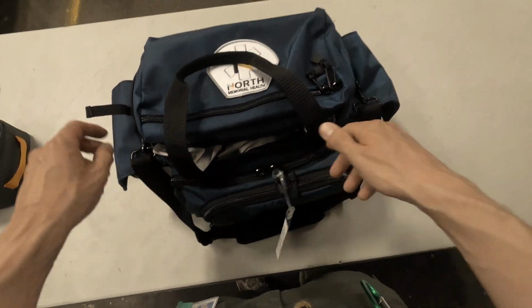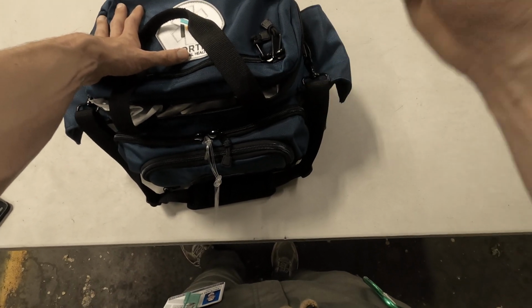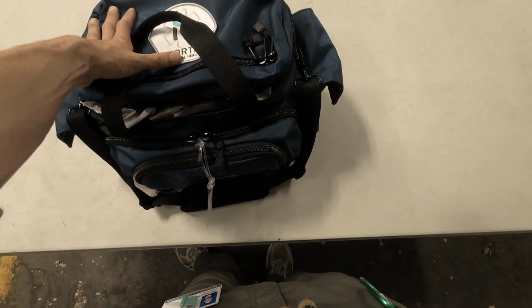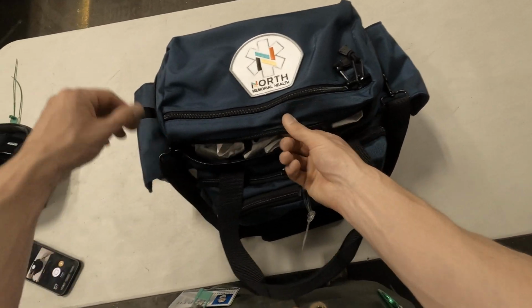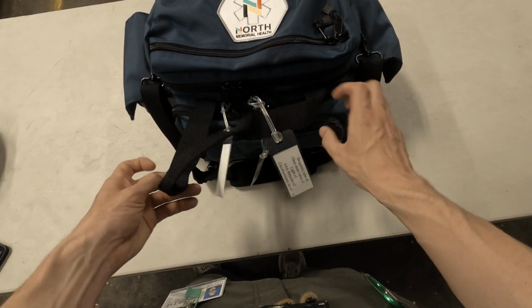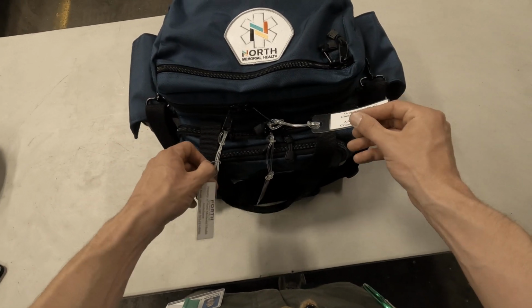So if for some reason a pediatric tube has a broken cuff, or if you need to put in a cuffed tube, you can put the bougie down the tube, get good placement, take the tube out, put a new tube on, and then you're good to go. They are not currently, by protocol, letting Metro Critical Care intubate PEDS patients, and that might be something that we can discuss in the future, but that's currently what their expectations are.